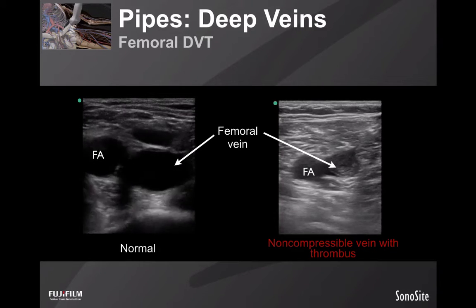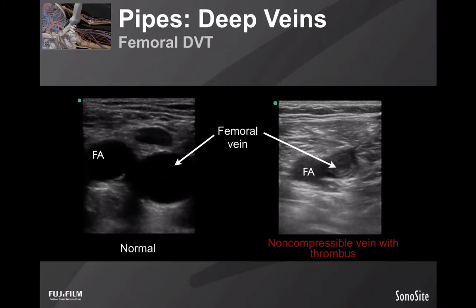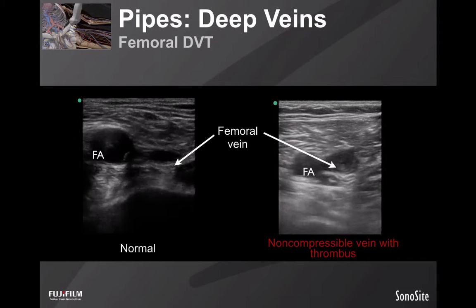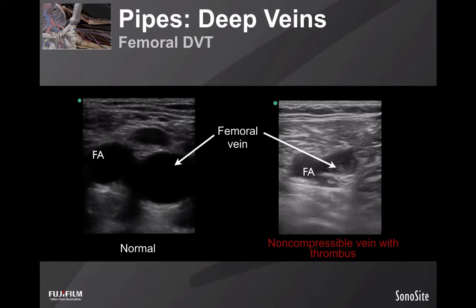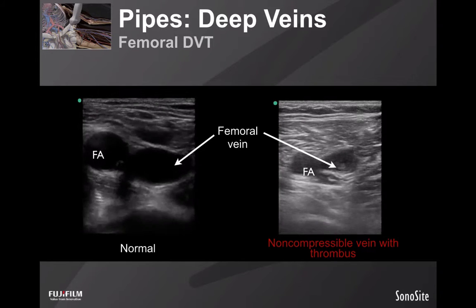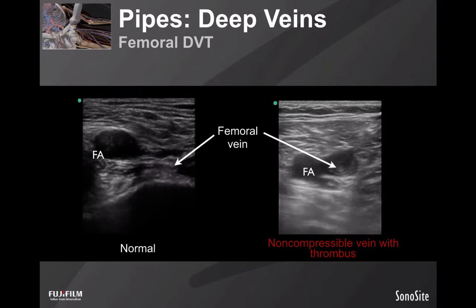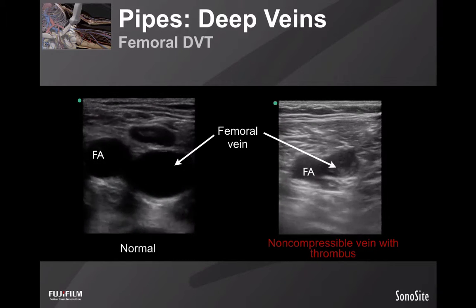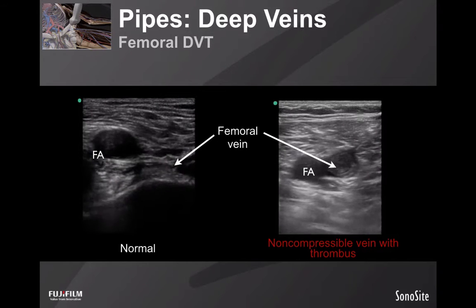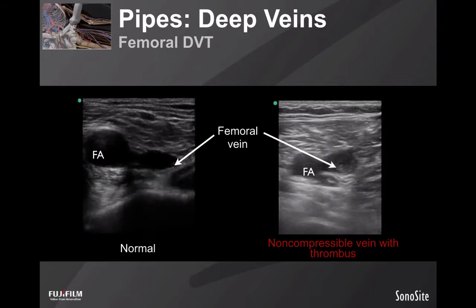We know that the majority of pulmonary emboli originate from lower extremity DVTs, and clinically significant clots, especially those that cause PE and shock, are usually large and extend between multiple sites in the lower extremity. Research has shown that a limited 2-point compression exam at the common femoral vein and popliteal veins is an accurate and acceptable alternative to whole leg DVT ultrasound. In fact, many emergency radiology departments perform a 2-point exam as opposed to the whole leg exam.